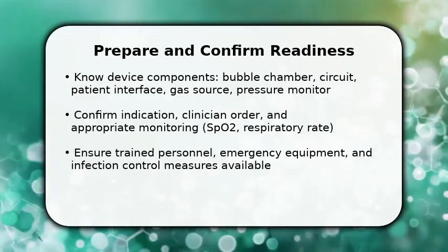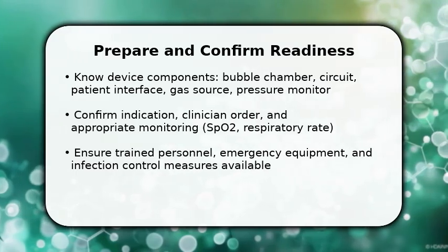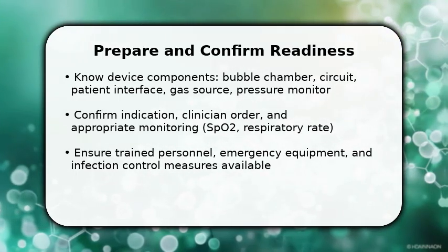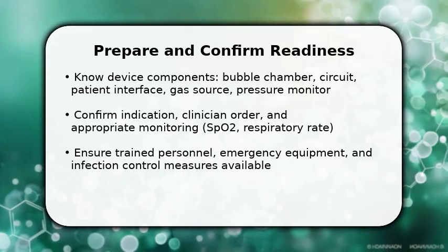Please enjoy the video. You will not get a step-by-step setup here. Instead, I'll orient you to what matters. First, identify the device parts and the clinical goals, gentle airway pressure to support spontaneous breathing.